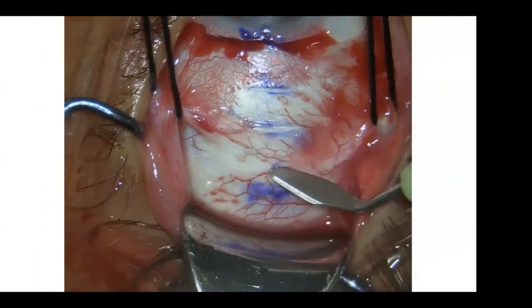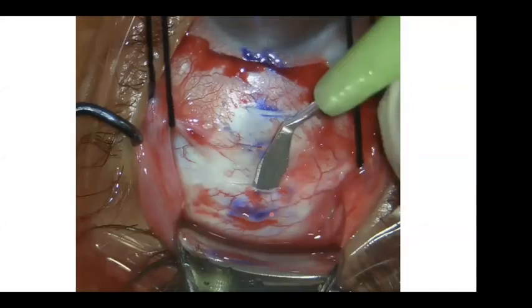And then I divide this area again into 3 millimeter areas, and then I start dissecting tunnels. When I dissect the tunnel, I use the crescent blade and I make it on the surface of the sclera. I don't use it perpendicular. It is just, the foot is resting on the sclera. So I'm applying pressure on the sclera while dissecting.